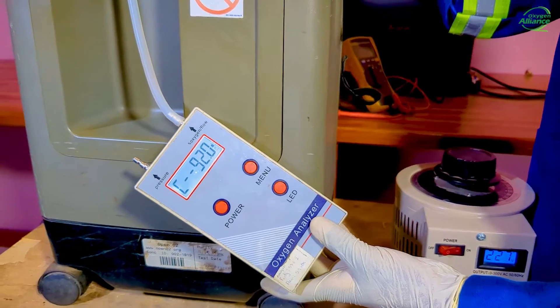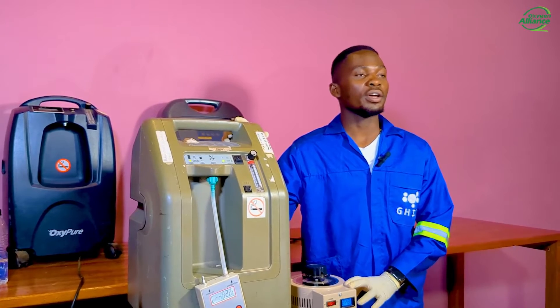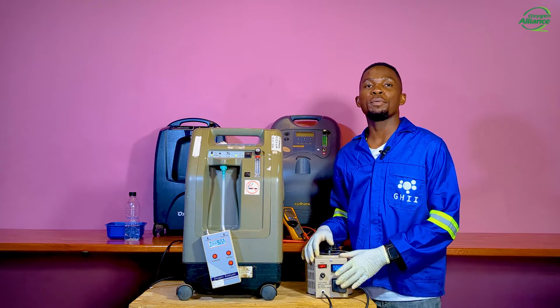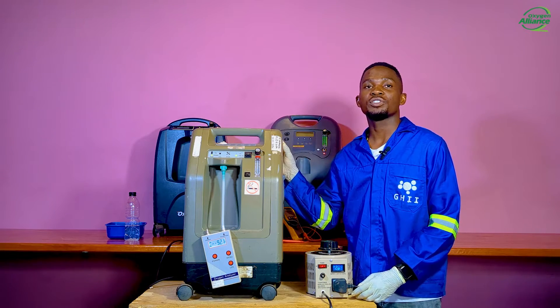This shows us how vital it is to consider the issue of voltage when running an oxygen concentrator. It is very important to check the power supply when you are getting low oxygen purity on the oxygen concentrator.